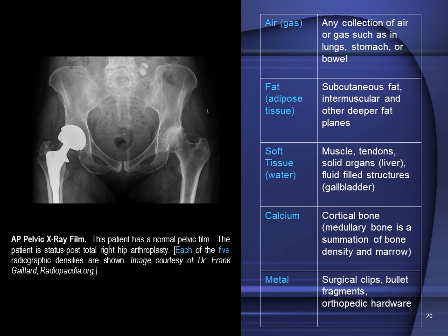We can see the distal parts of the pelvic bone, including the ischium, the pubis, pubic crest or symphysis. Actually, this is the crest here. Here's the symphysis, and the obturator foramen, and the proximal femur, the head, the neck, greater and lesser trochanter, the diaphysis, the proximal epiphysis.